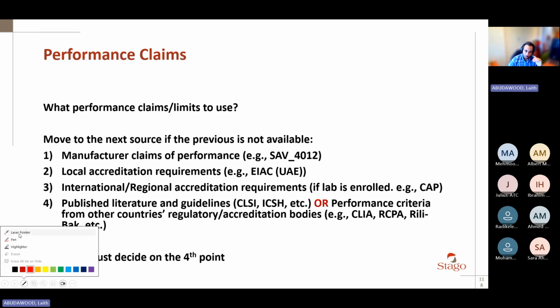This is not what I used. I did not use CLSI. This is what you would practically normally do in the field. CLSI tells you that you should use the clinical amount of error that's acceptable, that does not leave a clinical impact on the patient, but that's very difficult to estimate, etc. So what's in CLSI is different from what's practically applicable in the field, and they acknowledge this, by the way, in their documents. So in the field, what do I do?